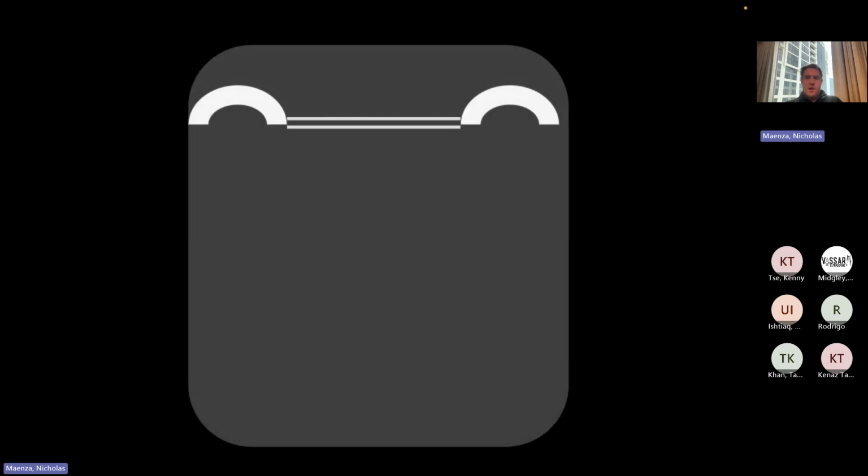All right, so I made this cartoon. I'm going to be using this throughout the lecture to have the most simplified version of what pathology you're looking at. So again, rib, and then you would have a shadow here, and then rib with the shadow, and then you're looking at the parietal pleura and the visceral pleura right here.